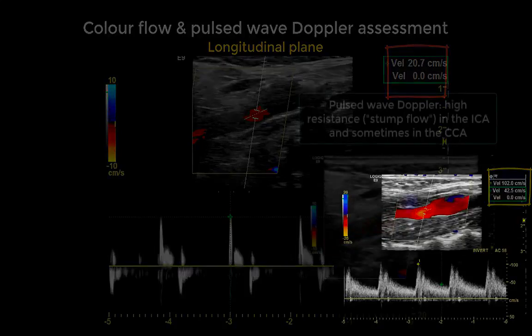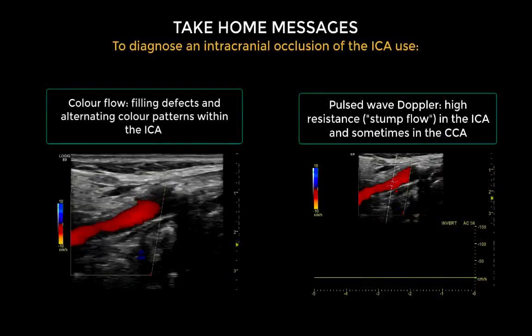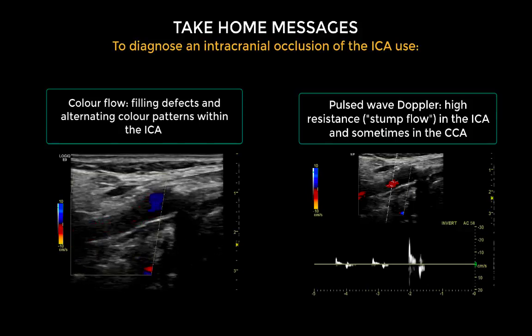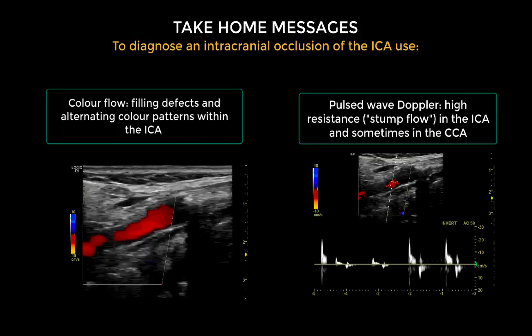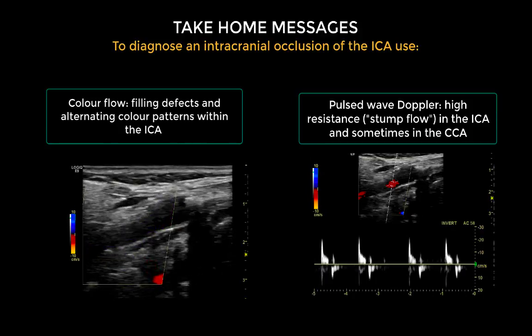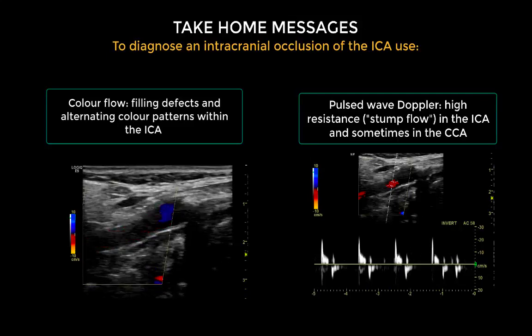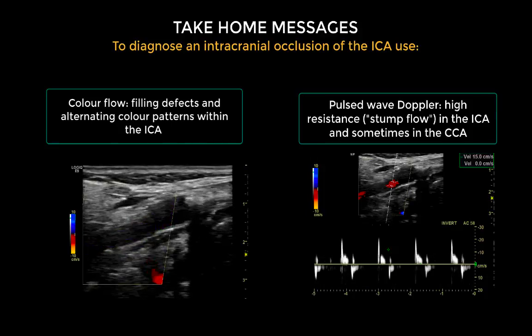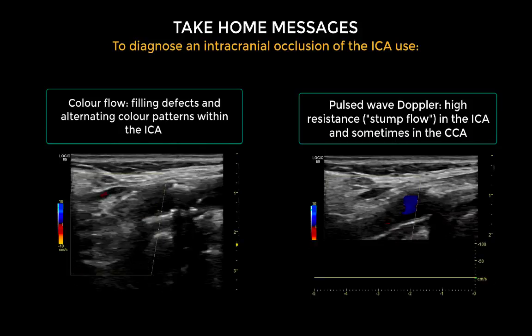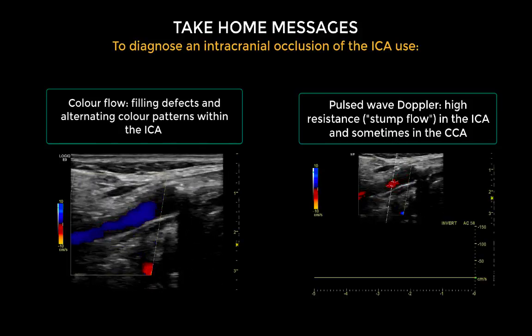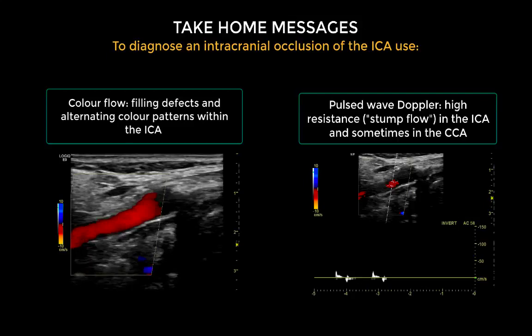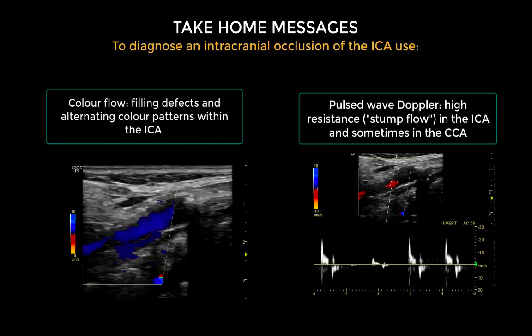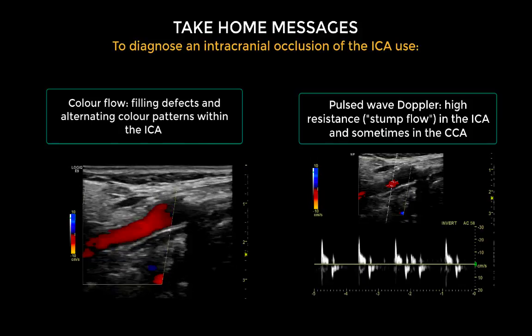The take-home messages from this case are: colour flow abnormalities such as an alternating colour pattern may indicate distal obstructive pathology at intracranial level, and a stump flow waveform within the internal carotid artery is also indicative of distal obstructive pathology. Remember that you can only make a suspicion of intracranial obstructive disease — the patient will need further imaging of the intracranial circulation to confirm or exclude the diagnosis.